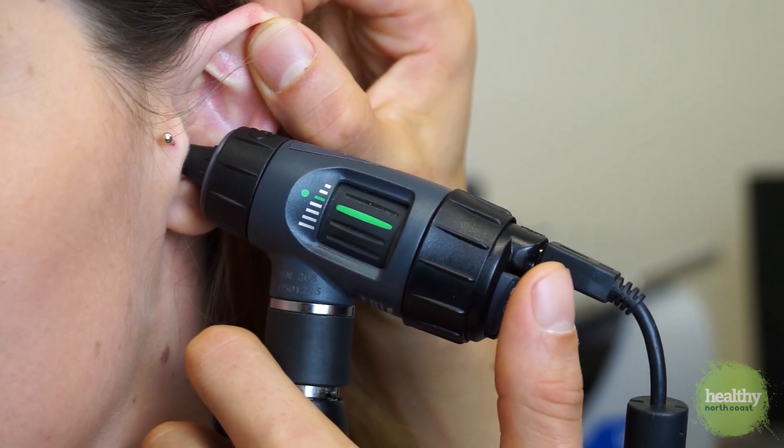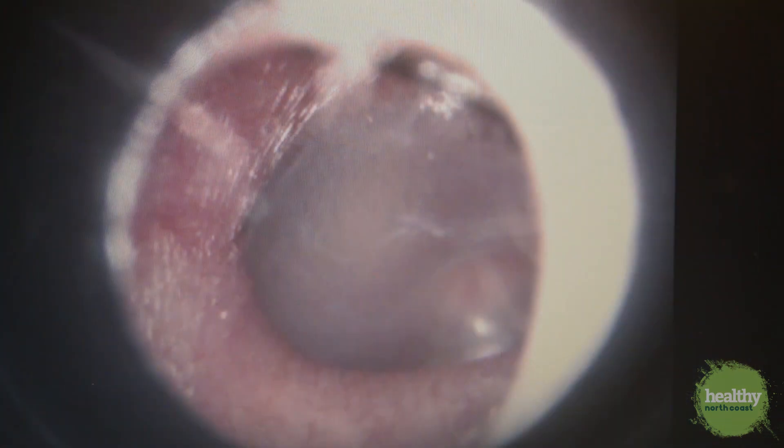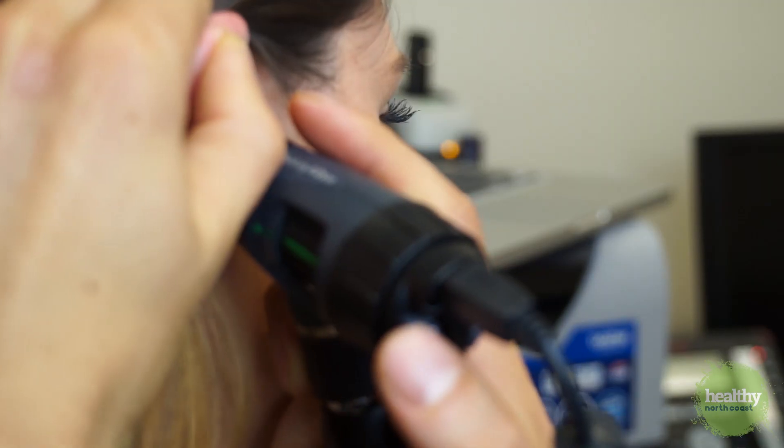Once you've obtained a clear view of the eardrum, take a photo. When you're examining a child you can easily flip them back and forth to see both ears. Adults, though, will either have to turn around in their seat or switch seats with you.